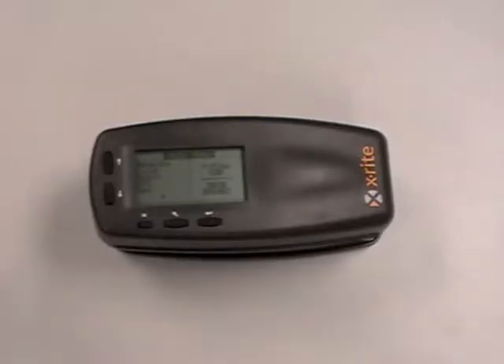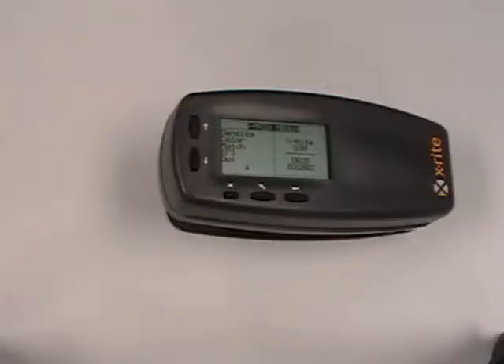Hello, this is Jason Hedgecock with X-Rite's Application Support Department. Today we're going to be discussing the 500 invalid measurement.